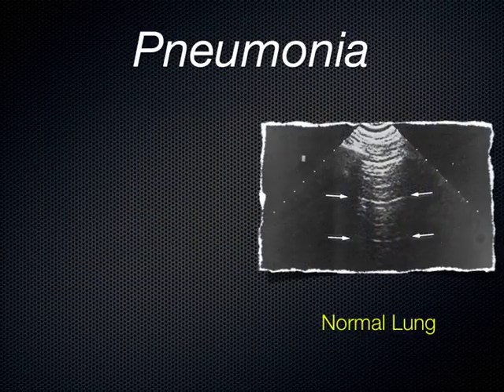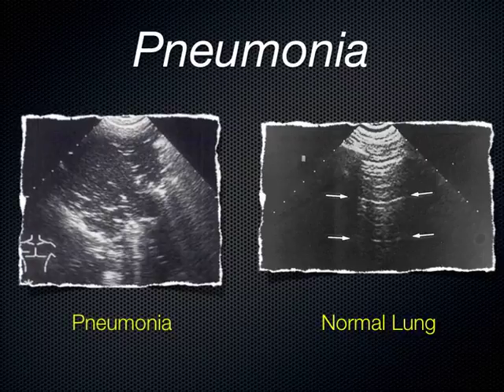So if you go in all 8 of your quadrants, basically, quadrant on both sides, you might be able to even say this is a right upper lobe infiltrate and compare that with your chest x-ray, because not everybody has full, and it's a good thing, not everybody has full pneumonia on both sides. You might have one lobe affected on either side, and you can start to hone your skills by trying to find it and then comparing it to the chest x-ray.